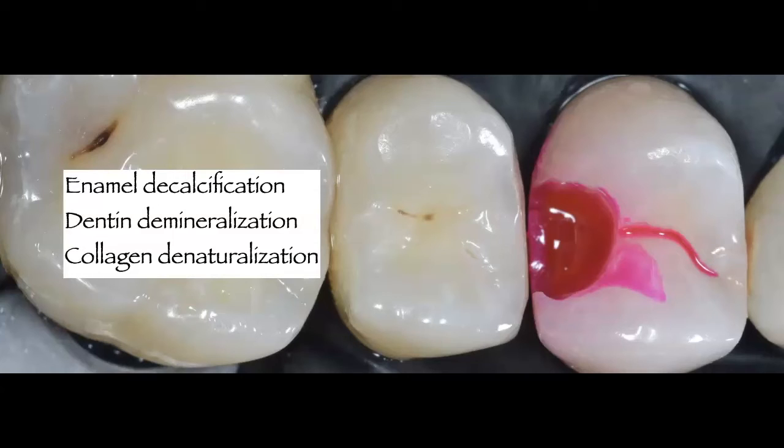closer to the pulp. So we have to make sure that, based on the age of our patients and the size of the pulp chamber and the depth of our preparation, we are very careful when dealing with that inner caries dentin, because it's closer to the pulp, and we have greater risk of pulp exposure, and we want to try to keep our teeth vital. We want to try to keep our teeth with no pulp exposures.